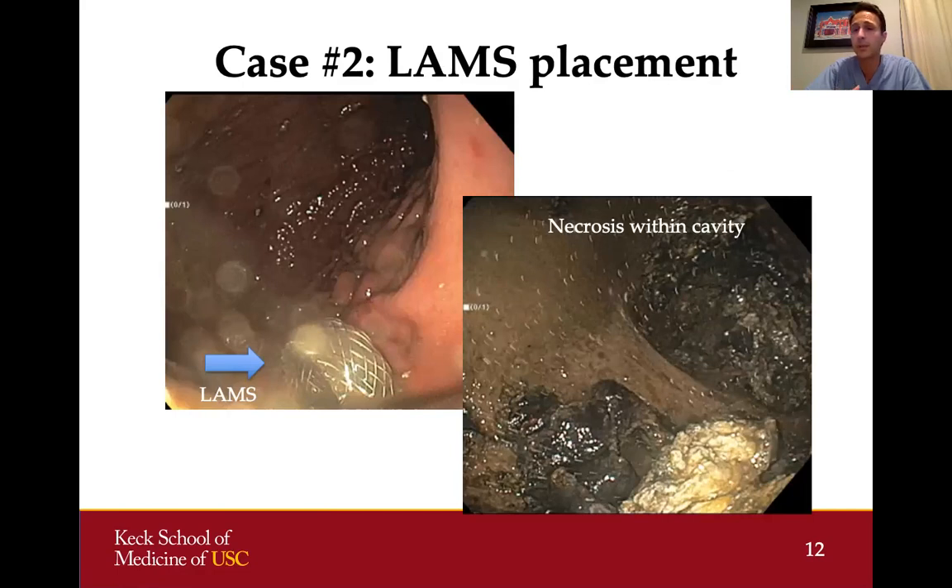The lumen-opposing metal stent also gives us a portal of entry into the collection if we want to perform necrosectomy or other interventions. We went through the stent with our endoscope after dilating it, allowing entry into the cyst cavity where we could see all of the necrotic material. Some approaches leave the drain in place and let the necrosis drain over the next few days, or you can go in and start removing material right away.